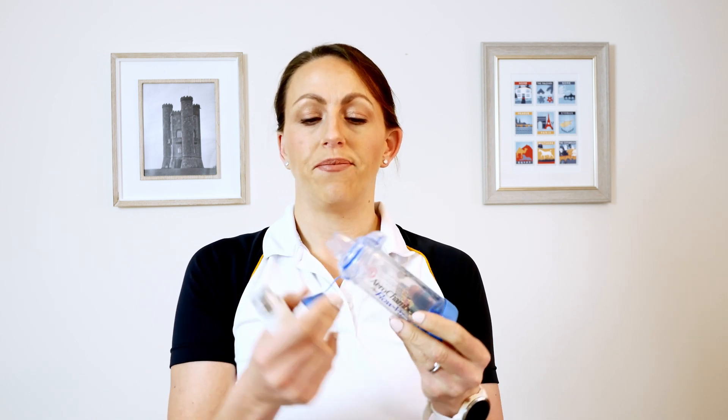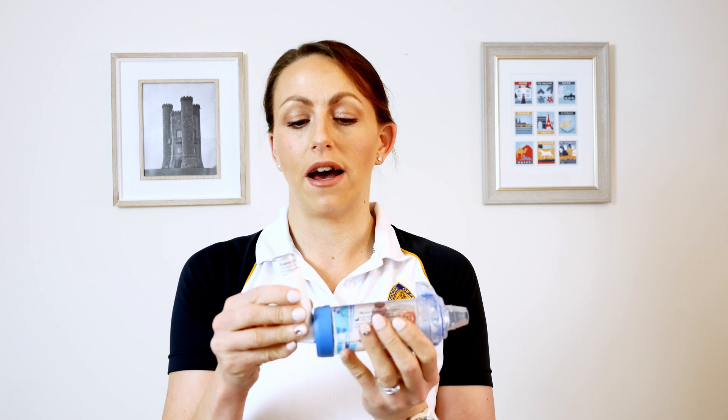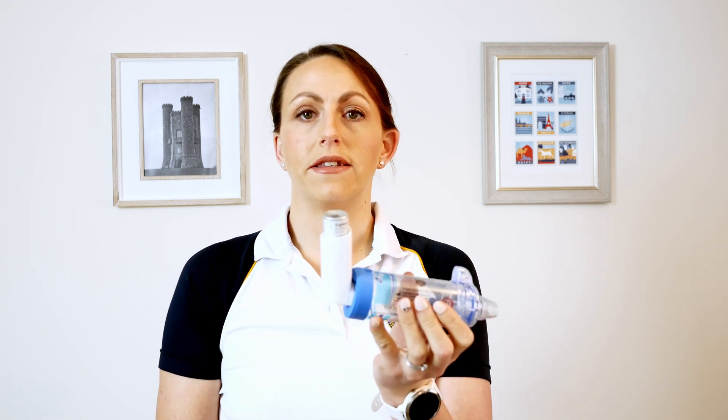The first thing you would do is shake your inhaler, because we know that mixes the propellant and the drug together. Take your lid off, then take your lid off your spacer so you're ready to go — you can just twist that round like that. Check that there's nothing in the inhaler and that it's in date, then put it in and seal it into the spacer.